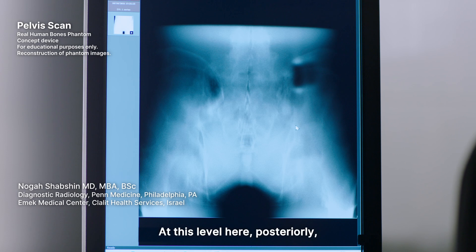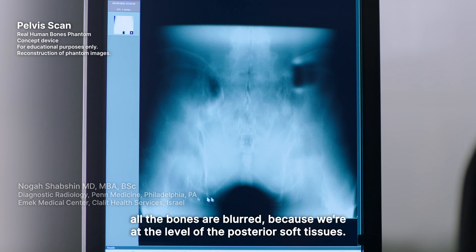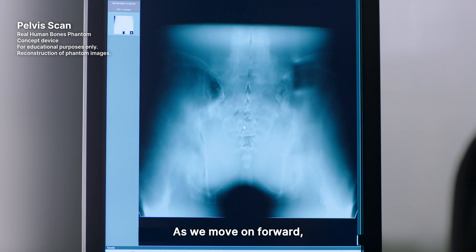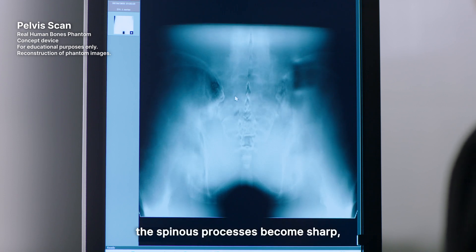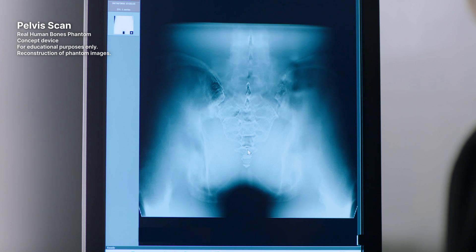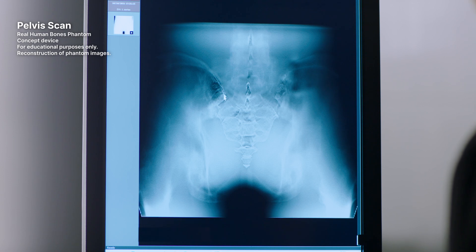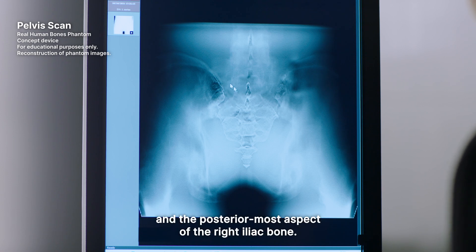At this level here, posteriorly, all the bones are blurred because we're at the level of the posterior soft tissues. As we move forward, the spinous processes become sharp, as well as the sacrum and the coccyx. Look at the neural foramina here and the posterior-most aspect of the right iliac bone.